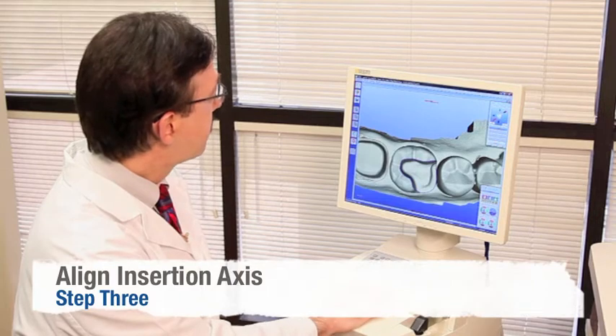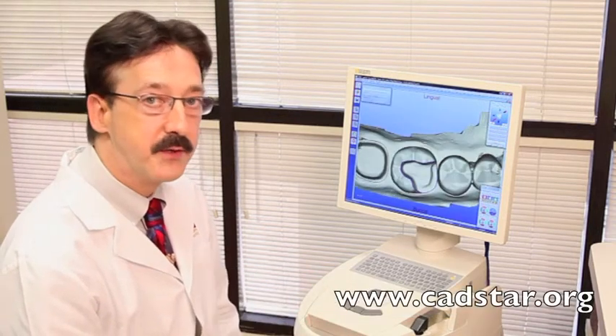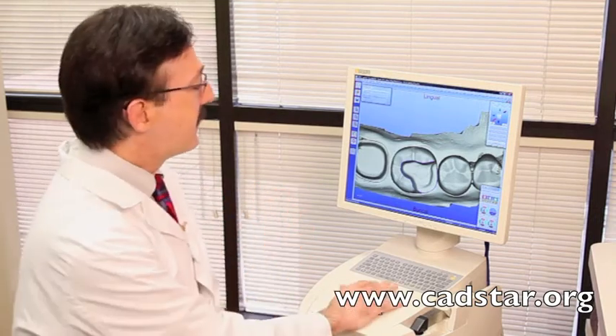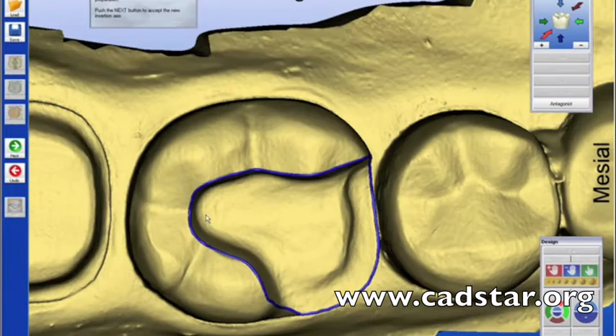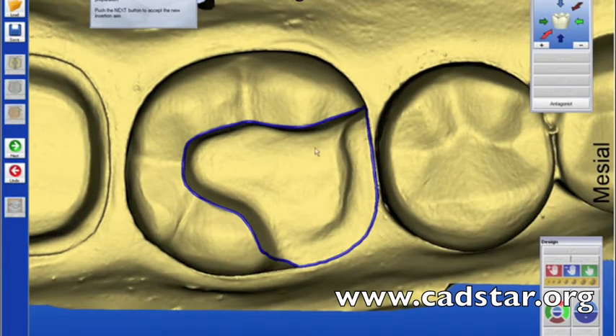The next step is number three: define your insertion axis. Here's an important principle about design — the interproximal contact surface of your second premolar should draw with the preparation. So when you're preparing a tooth, keep that in mind. If you need to recontour the distal of the interproximal contact surface of the second premolar, feel free to do that, because that's going to give you excellent control over your interproximal contact.